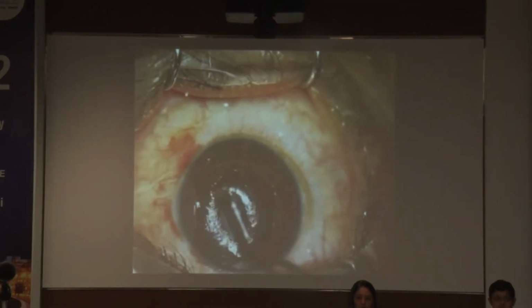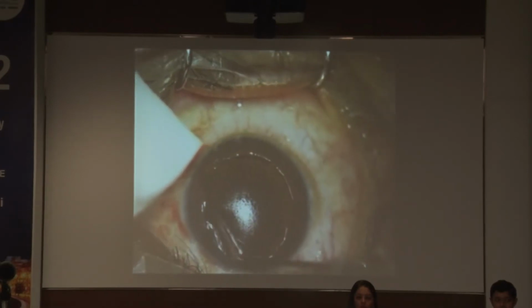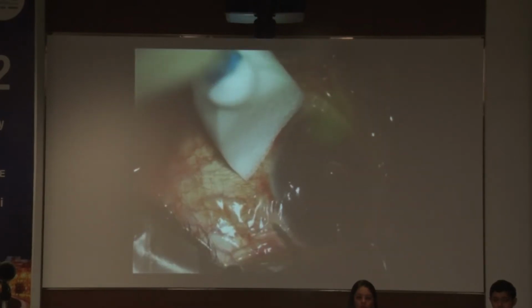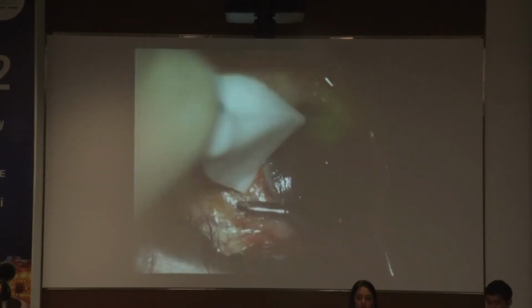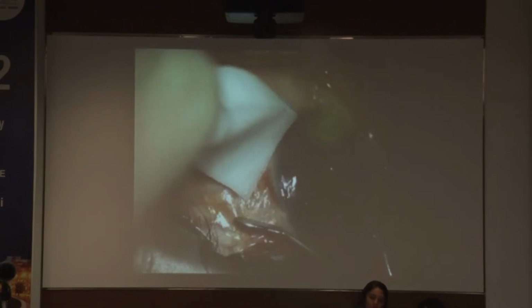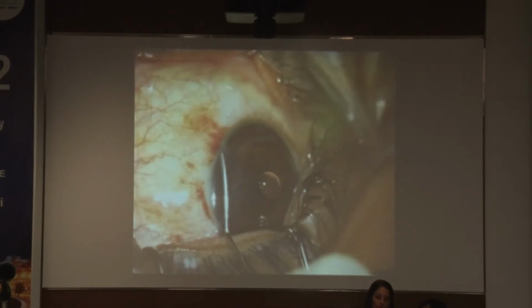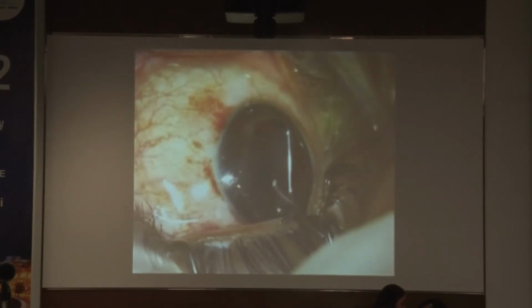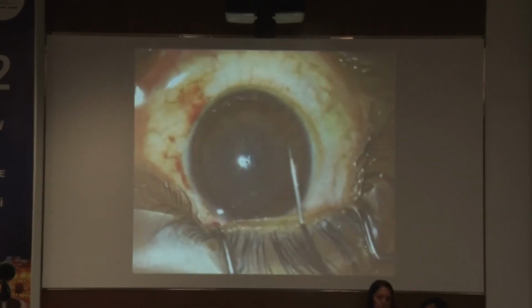This was again a traumatic dislocation. You can see that the whole flap is lying on the conjunctiva. So again, meticulous removal of all the epithelium. The flap is scrolled because of the epithelial ingrowth. Take care to completely scrape off all the epithelium. You cannot see it clinically, but you have to take as much care as possible to remove all the epithelium. Wash out nicely.